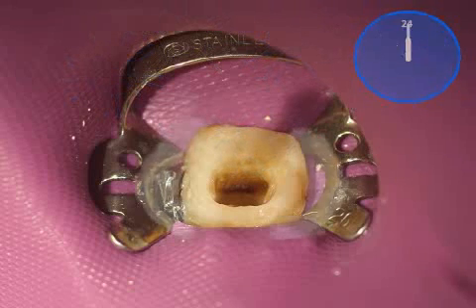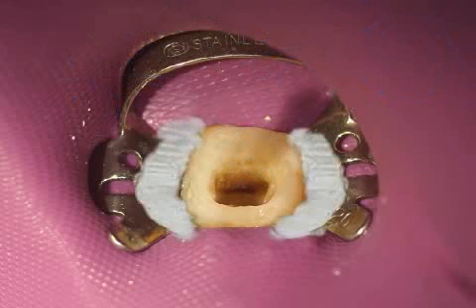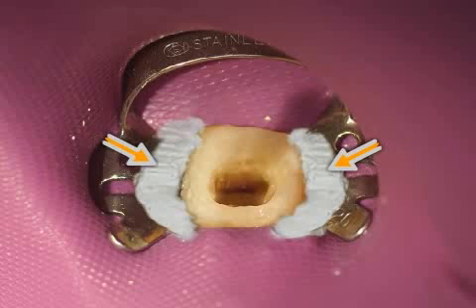Here you see an open tooth that is to be treated with a root canal. The membrane is kept tightly around the tooth with the aid of the dental dam clamp. In addition, a paste — the grey compound visible in this image — was used to meticulously seal the work area against saliva.